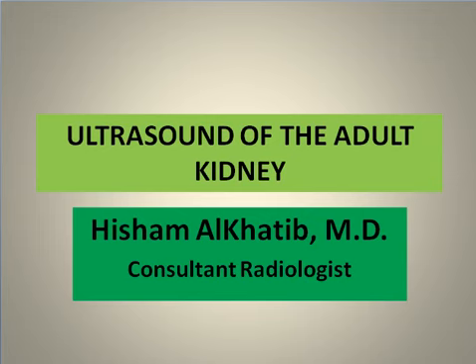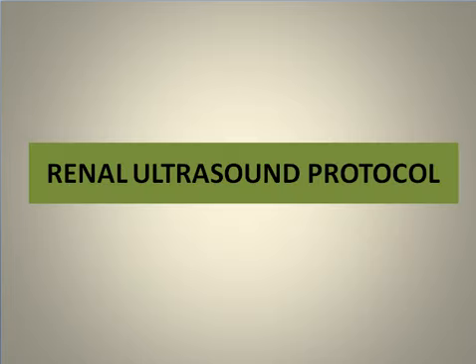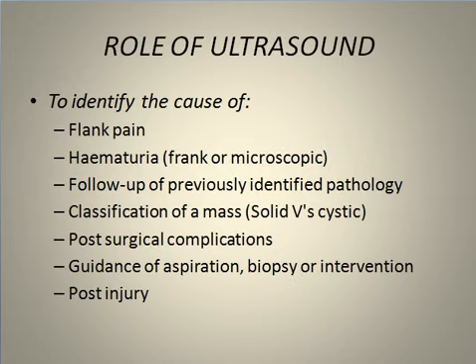My topic today is about ultrasound of the kidney in adult patient. Renal ultrasound protocol.